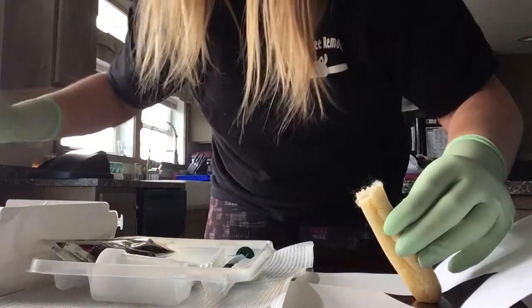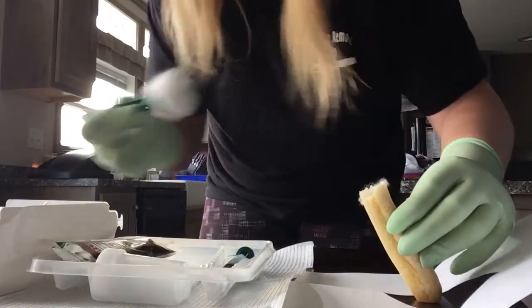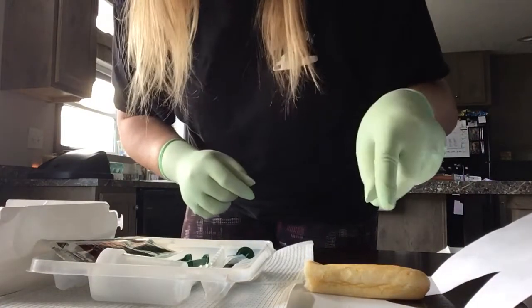Work from the top, swirl all the way down, until you're out of cotton balls. Put each one right in the garbage.